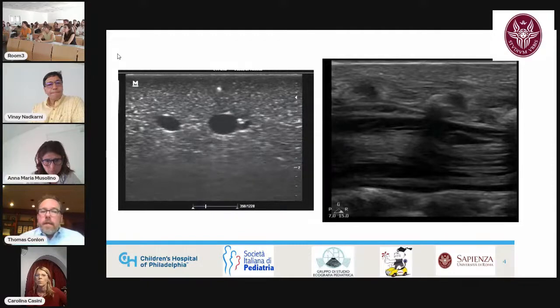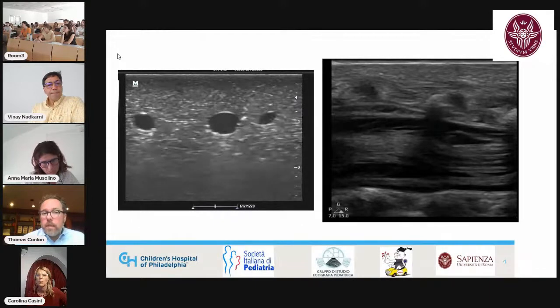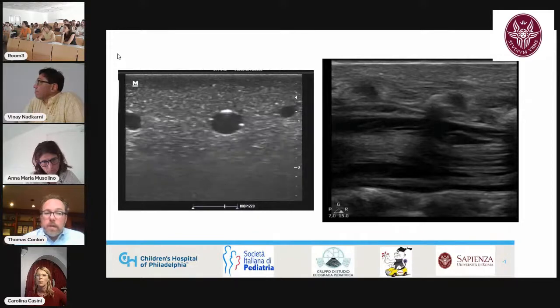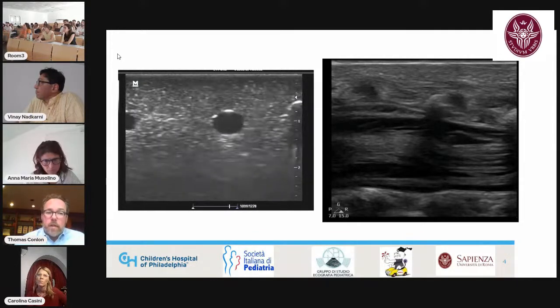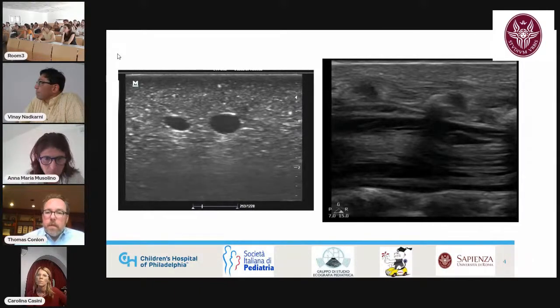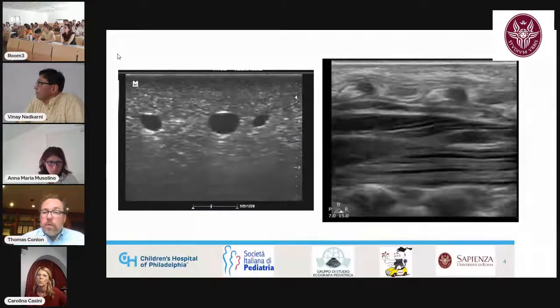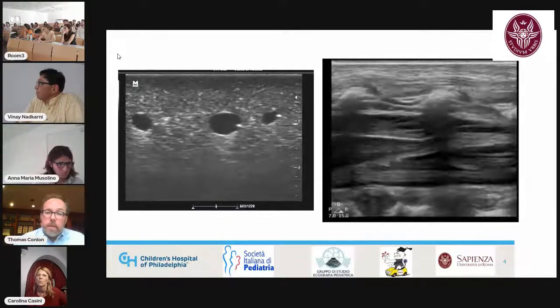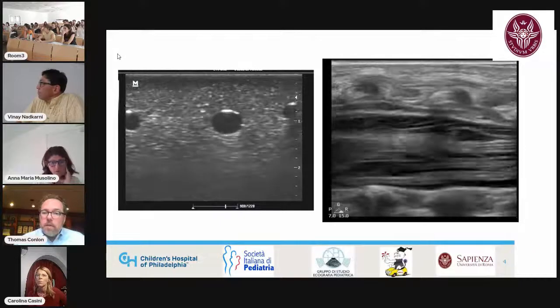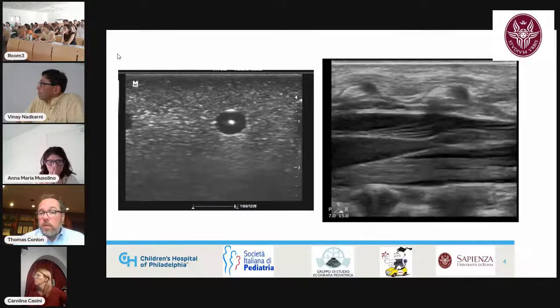So when we think of diagnostic ultrasound, we think about moving beyond just procedural ultrasound. As you can see on this left picture, this is somebody who's placing a needle into a blood vessel through a mannequin trainer, teaching themselves the proper way of using ultrasound for procedural success. You can also incorporate your knowledge of anatomy in helping you with your procedures. So this is a neonatal patient who is requiring a lumbar puncture. And you can see coming from the left, the conus, as well as the cerebral spinal fluid that you will be acquiring during your lumbar puncture.